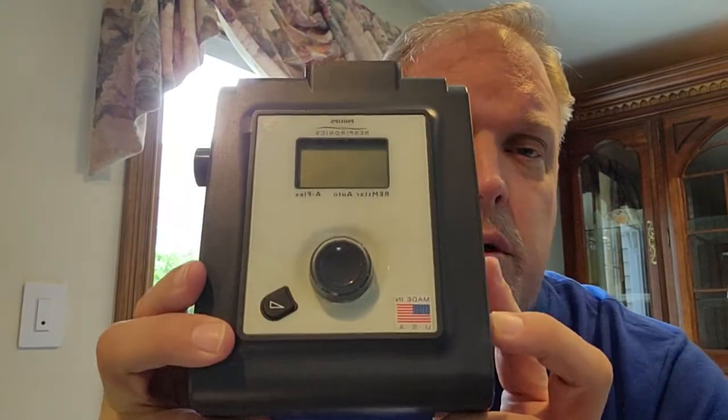Welcome everybody. This is continuing information on my Philips Remstar units — I have two old units. I understand there's been a recall recently and I've been aware of that. I have an old DreamStation that is under that recall — well, not that old, a few years. I use these units for my travel.